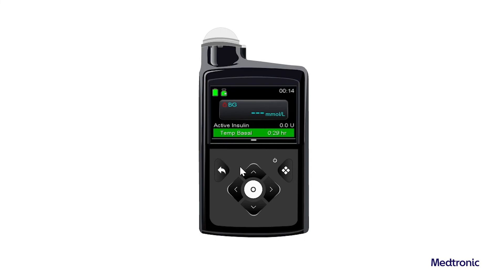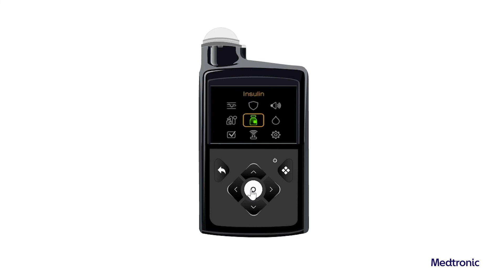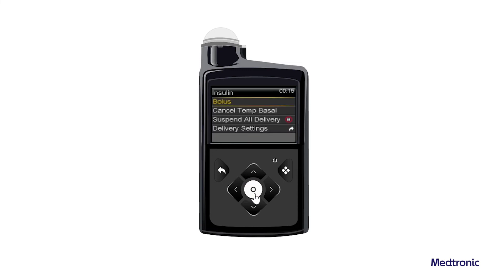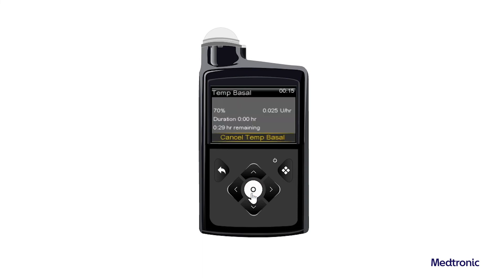To cancel a temp basal rate, from the home screen select insulin. Select cancel temp basal. The temp basal screen appears.